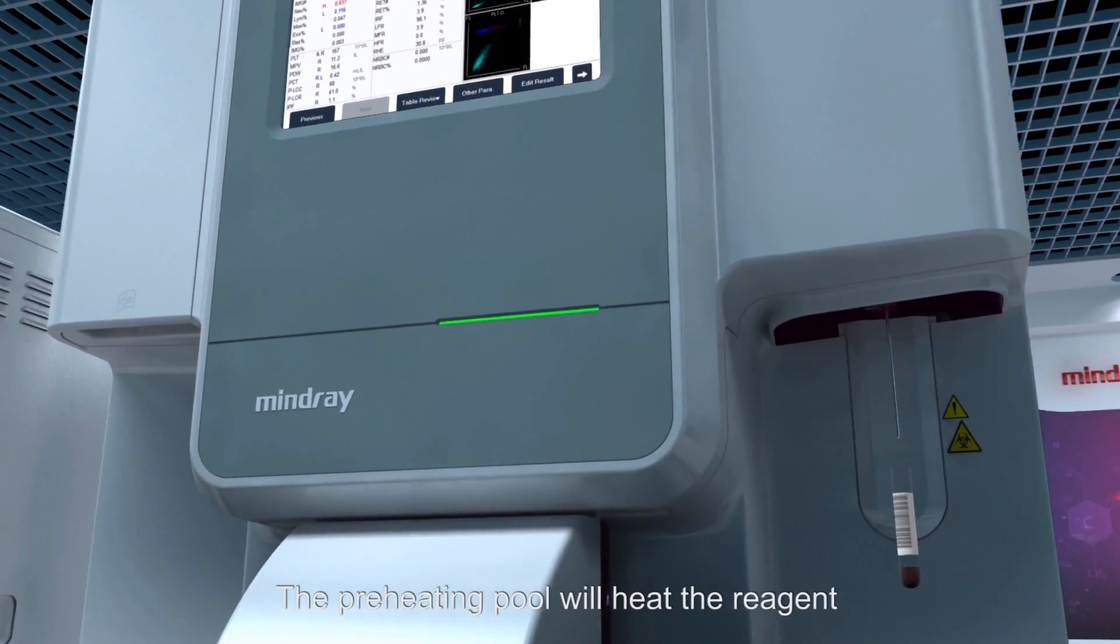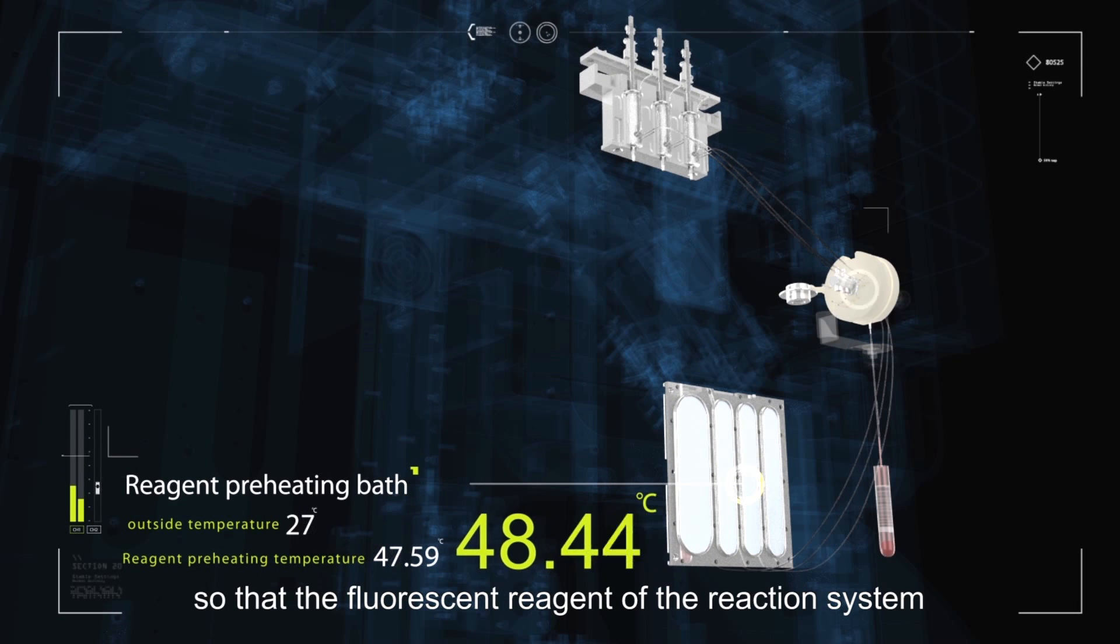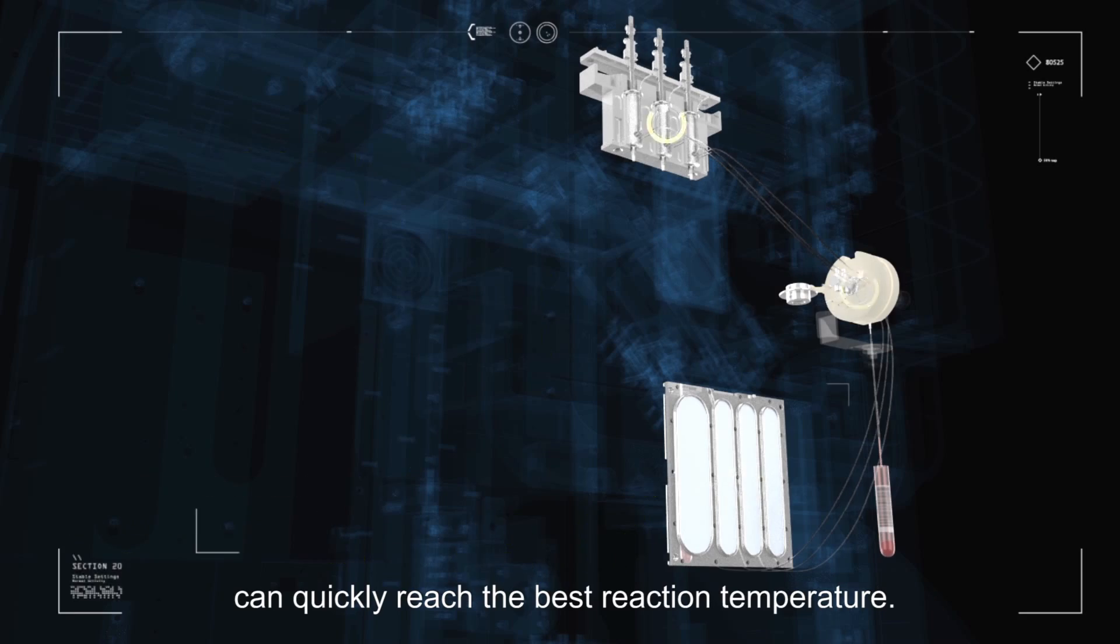The preheating bowl will heat the reagent according to the temperature of the environment, so that the fluorescent reagent of the reaction system can quickly reach the best reaction temperature.